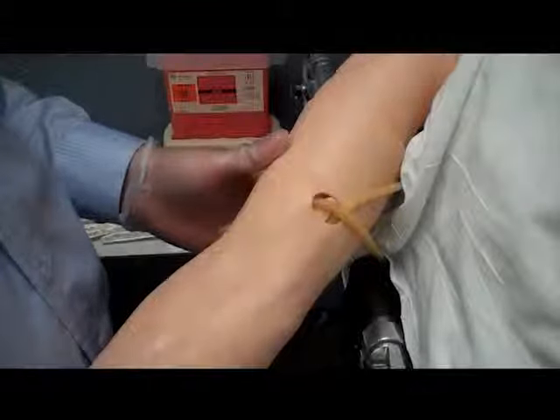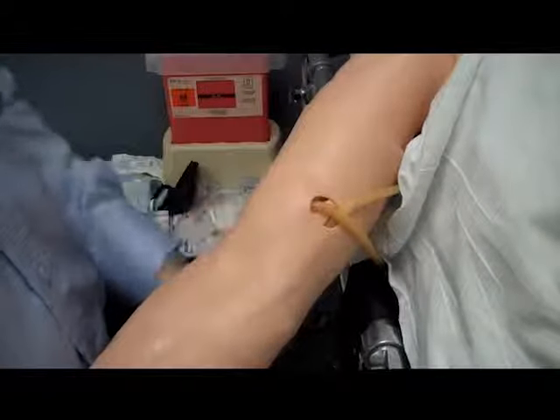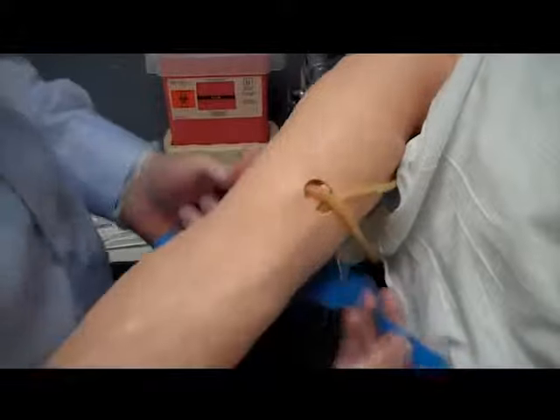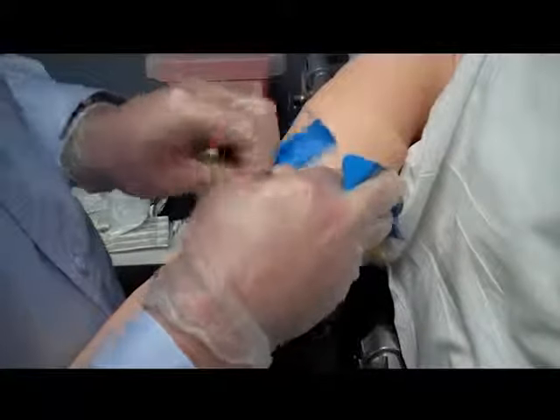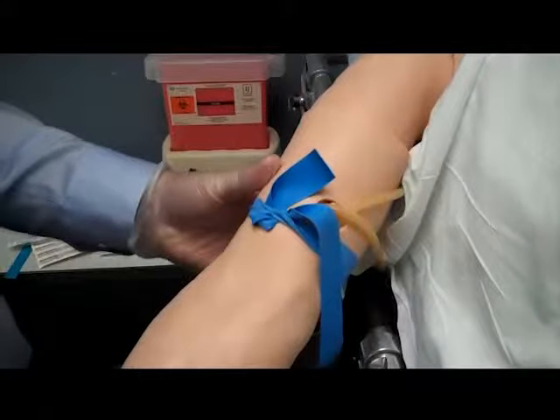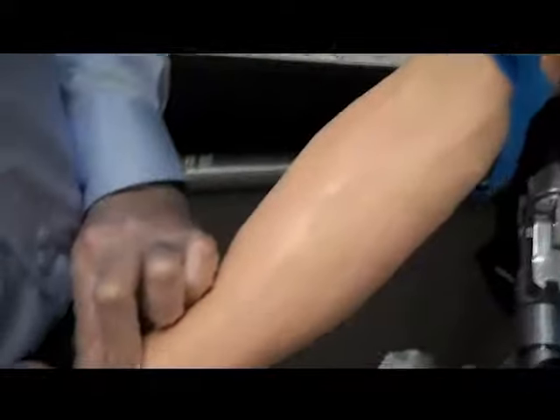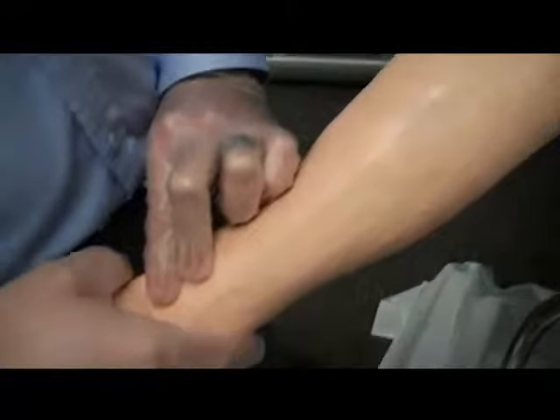In order to make the venipuncture easier we need to make the veins stand up. To do this we apply a venous constricting band above the puncture site. We want it at least two inches above the site. You don't want to put the band on a joint and you don't want to put the band on so tight you occlude arterial blood flow. Always check a pulse after applying the band. Remember if you can't start the IV within two minutes of applying the band take it off and try another location.